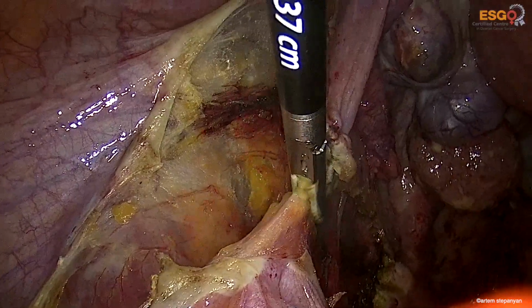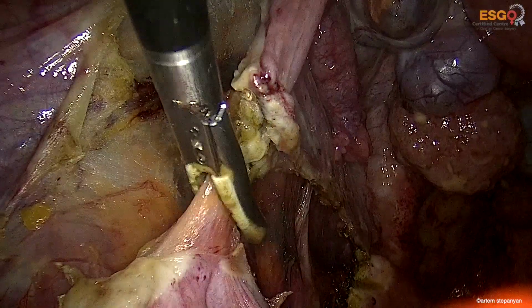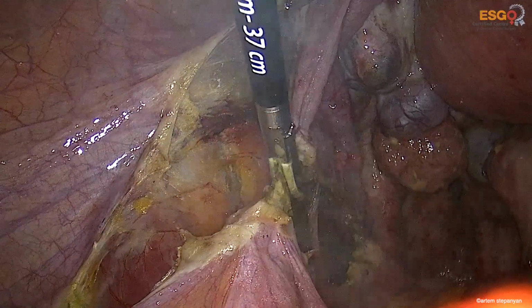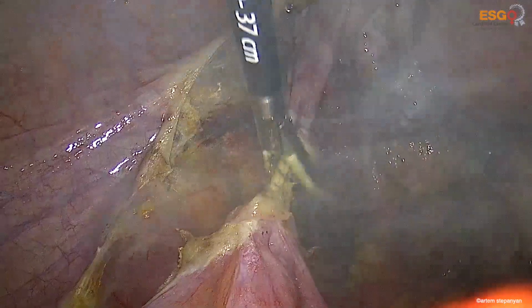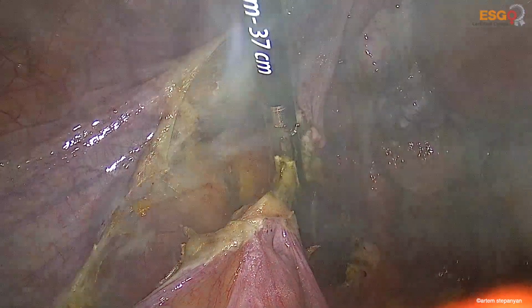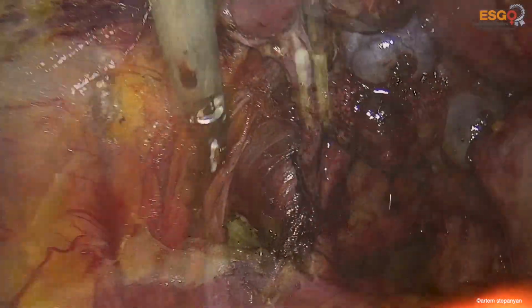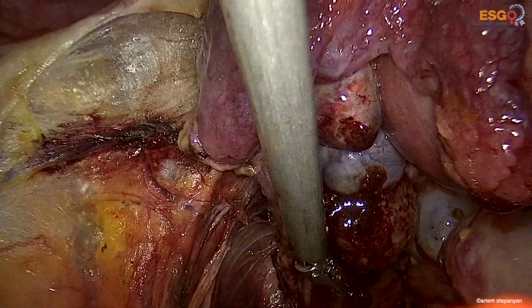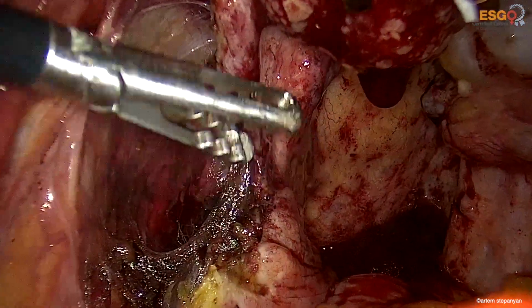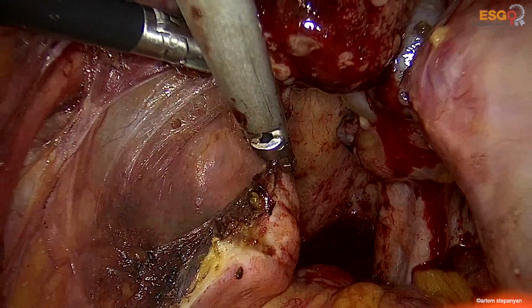Isolated IP ligament vessels and the uterine artery and veins are coagulated and cut by a laparoscopic ligature device. And now we have a better vision of the uterosacral ligaments and the Douglas's pouch.